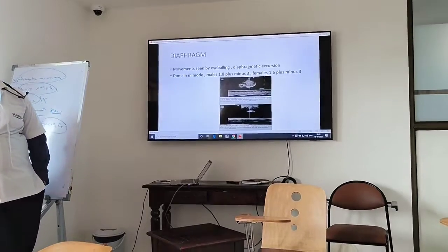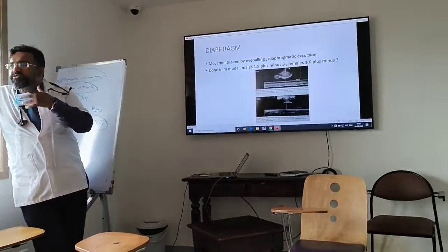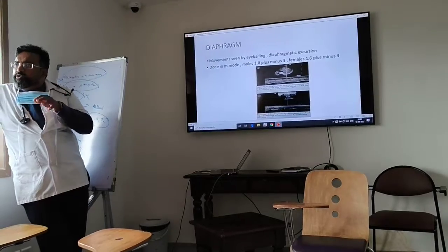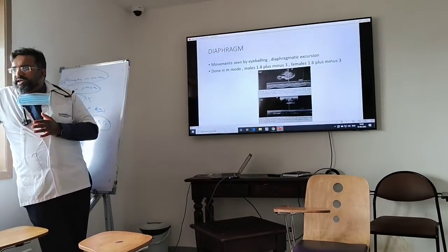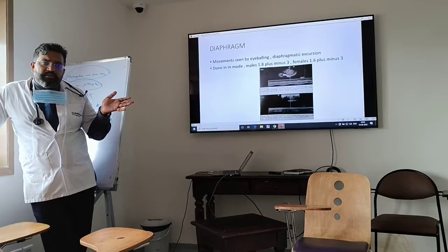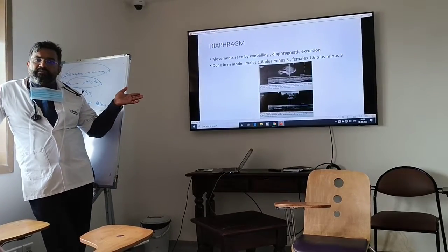It's together only, but mostly we are talking about weaning here, weaning failure. Weaning from the ventilator, weaning into a T-piece. So this is that patient in which you cannot put on a T-piece only. Forget about extubation. You're understanding? Because you're trying weaning here. Other way around, you may want to try for GBS patients to see how much the diaphragm is working. These are the ways you can actually figure out whether the diaphragm is working or not.